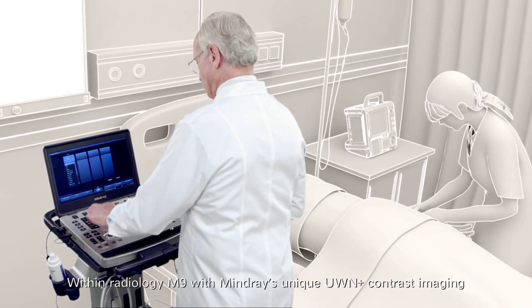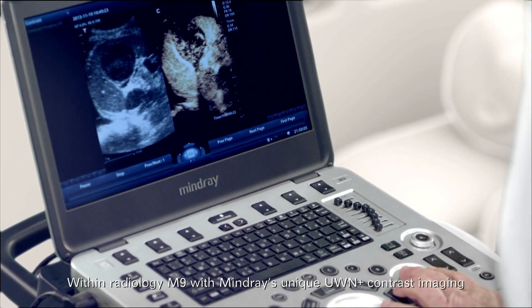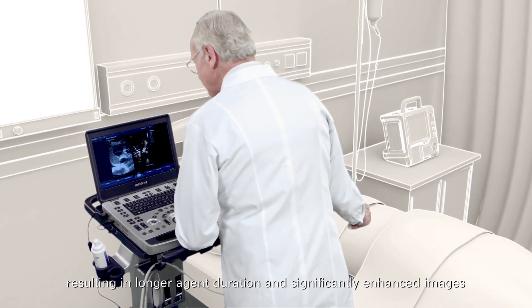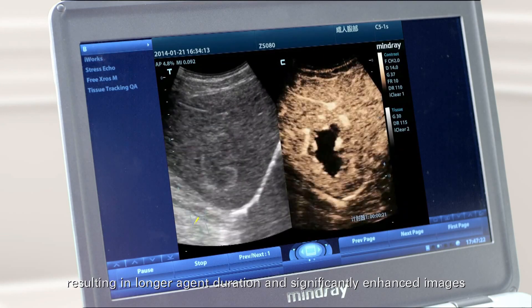Within radiology, M9 with Mindray's unique UWN plus contrast imaging is the best solution for bedside contrast, resulting in longer agent duration and significantly enhanced images.